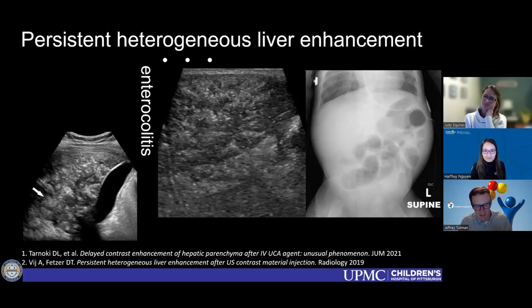Then another question about our quantification discussion. Are either of you using absolute values to determine severity of disease for bowel and Crohn's disease? No, I'm not using any absolute values. Most of the time I'm using the curve, and more so as a relativity.